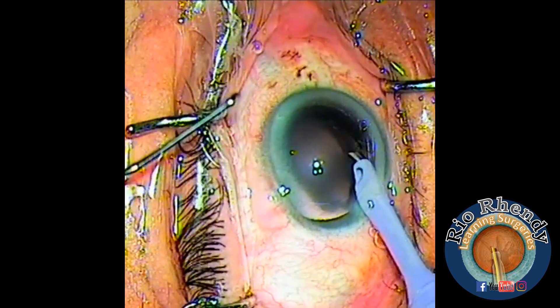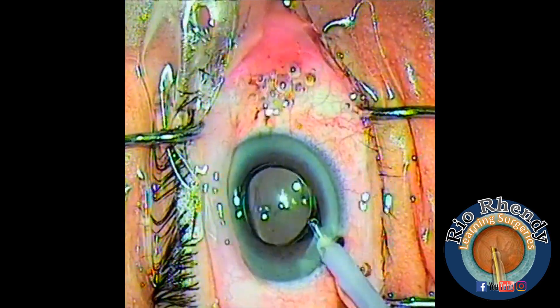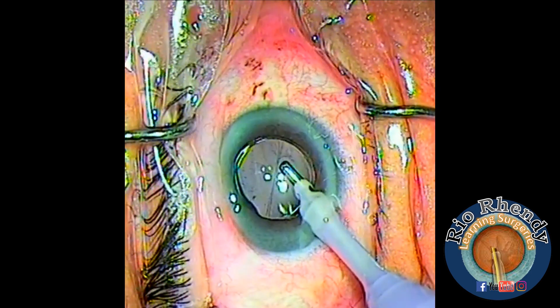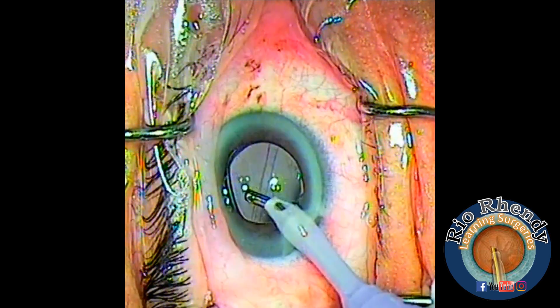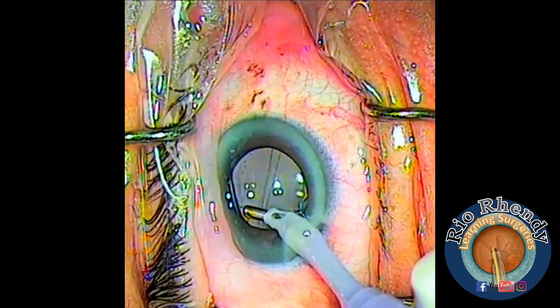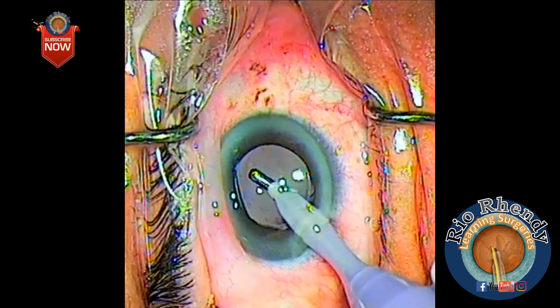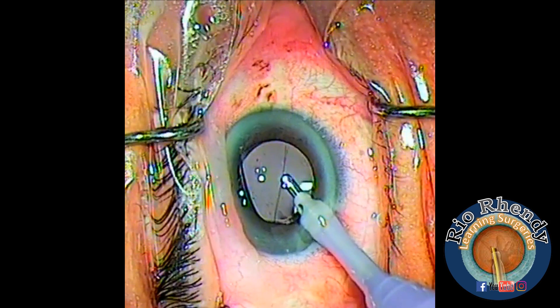Skipping ahead to the lens insertion. I'm using a sensor IOL — it's a big lens, so I need to make a bigger incision. Sometimes the iris can come out, so I put the I/A tips gently to keep the iris in place. I remove all the OVD in front of the lens and then behind the lens.